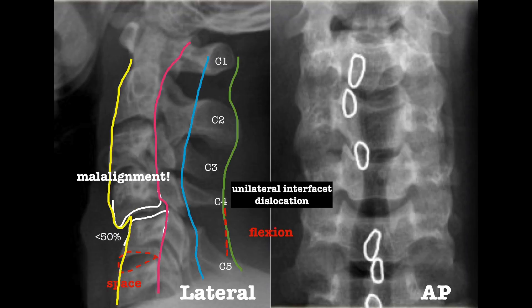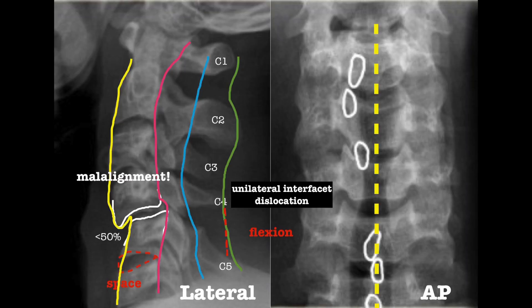Reviewing this X-ray: the C7-T1 junction is poorly visible. There is mild malalignment of less than 50%, suggesting a unilateral interfacet dislocation. There is hyperflexion at C4-5 with widening of the interspinous space. There is no obvious fracture or features of compression. There is increased disc space between C5 and C6, and the atlanto-occipital distance appears normal. On AP view, there is mild malalignment of the spinous processes, which can only occur due to a rotatory force. On the lateral view, note that the spinous processes of C3 and C4 appear short because of this rotation.